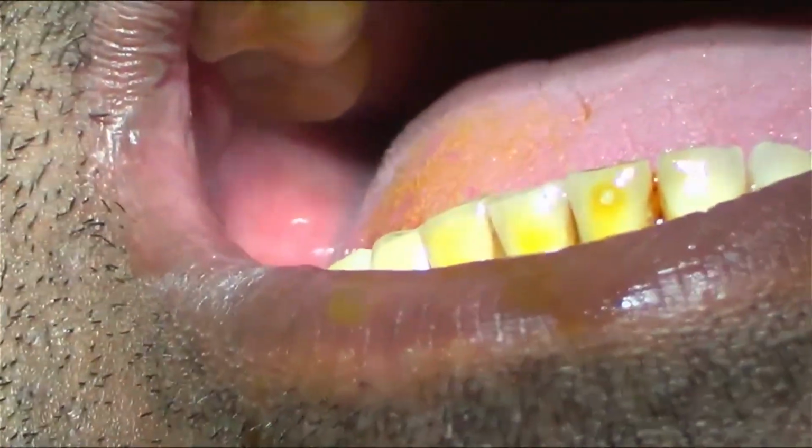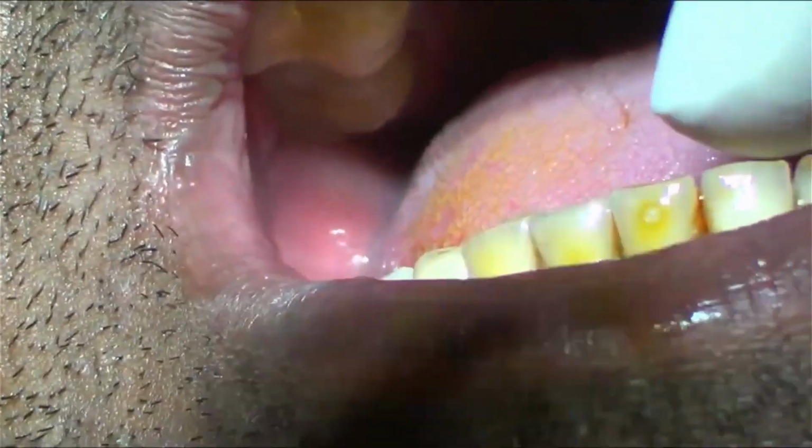Ideally, if it is an edentulous case, you should check the guide fitting before you have given the anesthesia. So we can check the guide is perfectly fitting well, no issues at all. If your guide is fitting well, then half of your job is done. Again, your guide is perfectly fitting well, no issues at all.